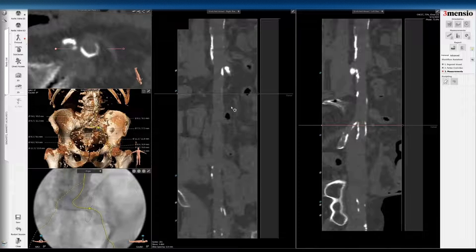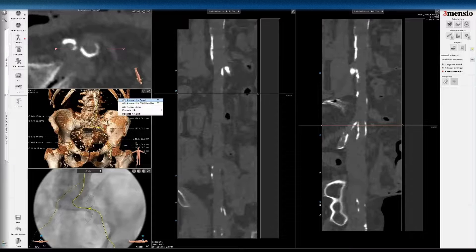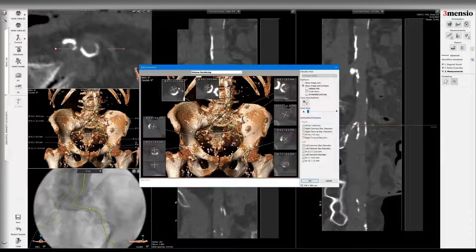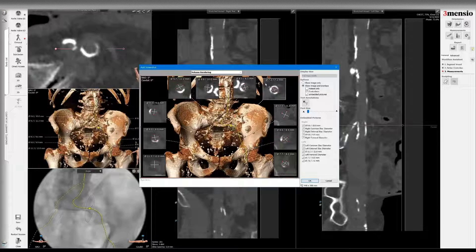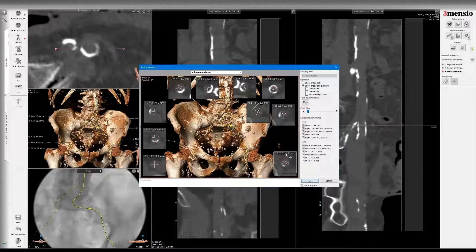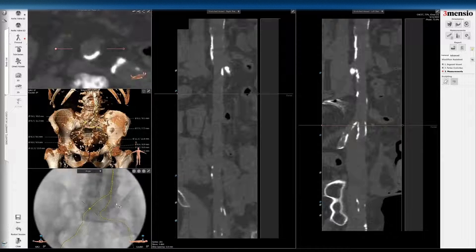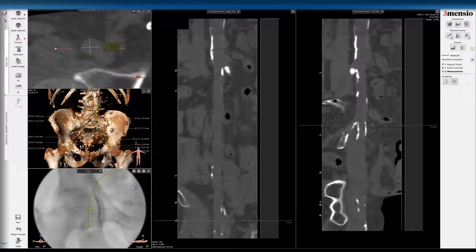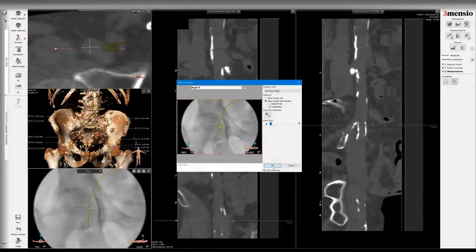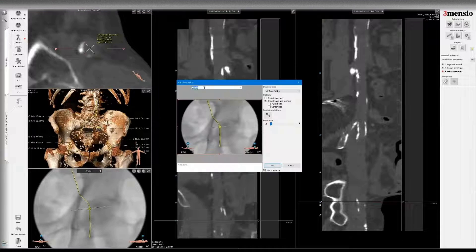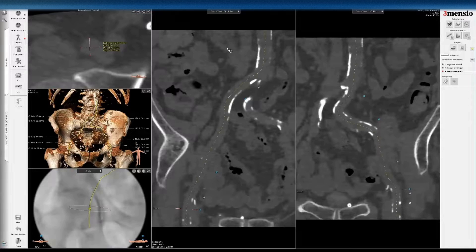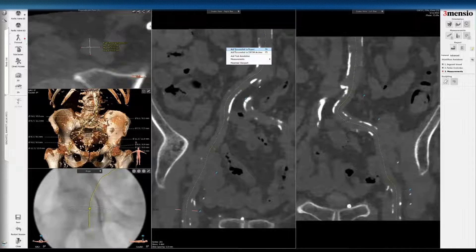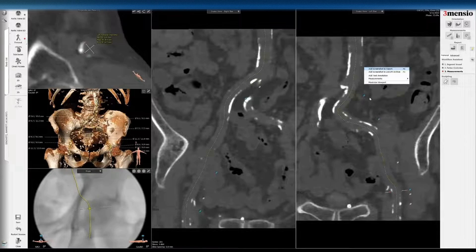You can also do a few more segmentations if you like. Now that we're done, you want to create a snapshot of the overall anatomy and layout. Make sure you draft these still shots so that they don't overlay, otherwise it's not going to be useful to the reader. Do a femoral overview and click here. This is the right access. Then go to the fluoroscopic view — this is kind of where the ideal puncture site is. And here you can see where the ideal left puncture site is based on the calcification. I put right and left. This is the centerline view, and then this is the snake view.